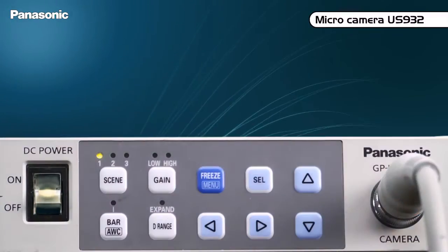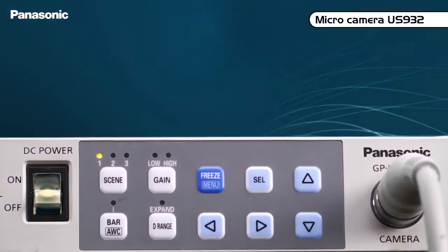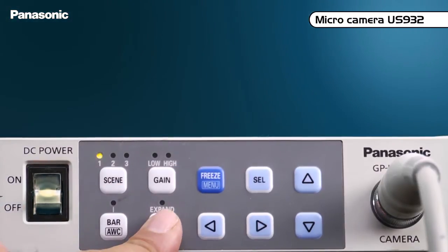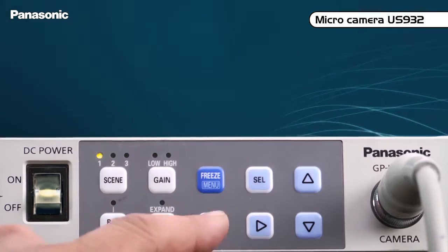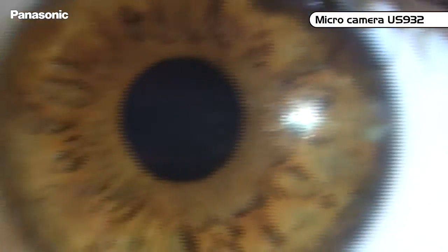On the front side, one will have direct access to a variety of functions: the selection of scene files, the gain setting, the automatic white balance, the derange function allowing to optimize the picture contrast, the freeze function, the direction buttons that will flip or rotate the image, and that will activate the 2.5x electronic zoom.